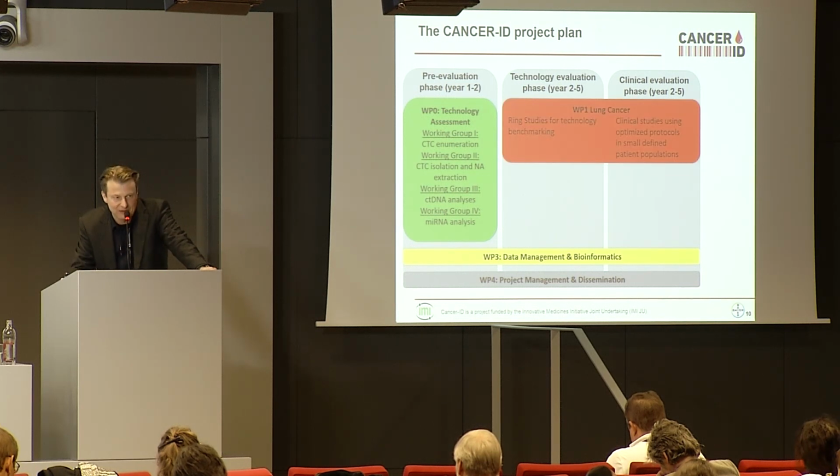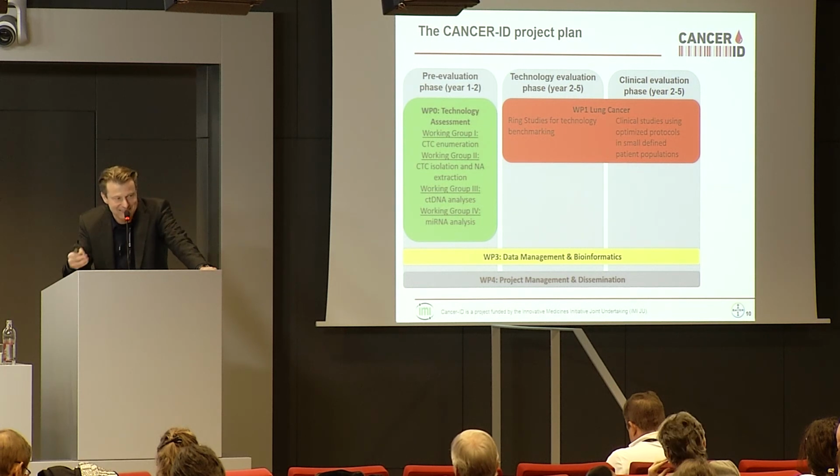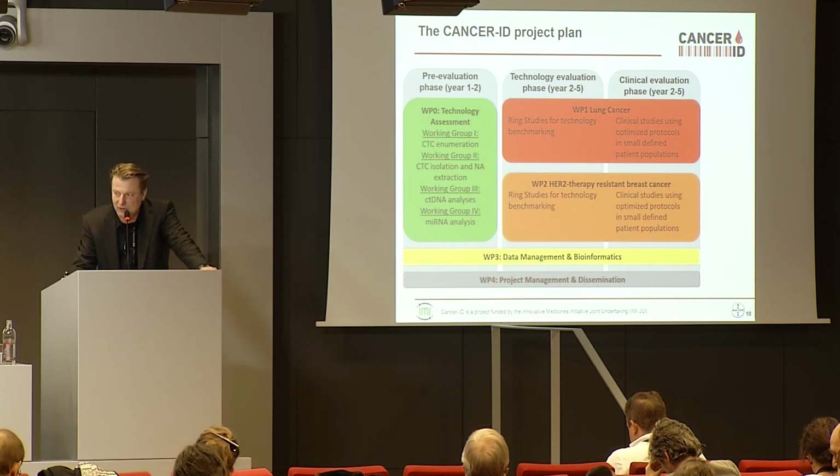So in the technical evaluation phase, we started to look into spike-in artificial samples. That is true for ctDNA, but also for circulating tumor cells, and try to establish protocols that can also work with clinical samples or test those protocols if they are already available from the technology providers. This is true for lung cancer and breast cancer, obviously. So ideally, we are looking at technologies that can deal with all the indications you're interested in. And finally, and we are moving into this phase now, we are trying to look at clinical cohorts to implement liquid biopsy tests there. And currently, our focus is shifting a little bit towards the immuno-oncology drugs and whether liquid biopsy can really contribute to selecting the right patient who has a chance to respond to those treatments.